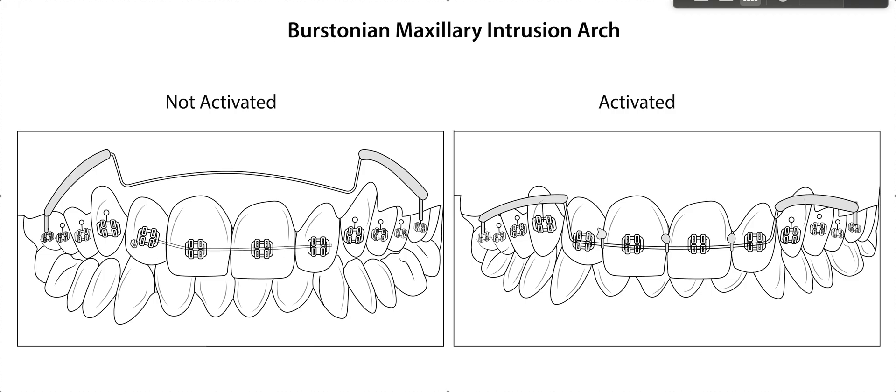Make sure you cinch back your NITI on each side. Then you're going to put it in the slot. I like the idea of putting the bumper tissue guard here because it keeps it from cutting the cheek. You're going to pull this down like a lever, and then once it's down, you're going to take three steel ties between one, two, three — twist them down. Of course, like any time you have a steel tie or a long tie, you're going to have a little pigtail at the end. I like the idea of putting a little tiny blob of composite on the ends so it's not uncomfortable — you don't have to worry about it flipping around and cutting the patient.